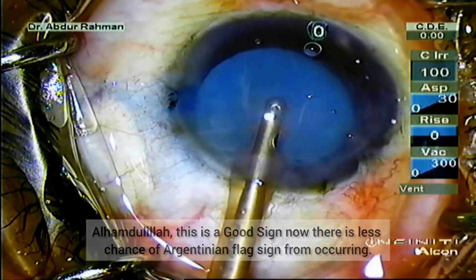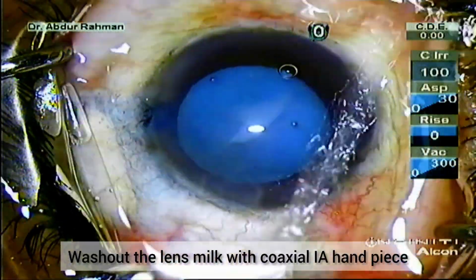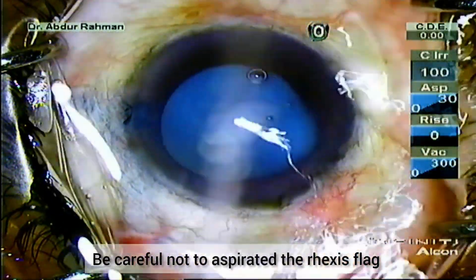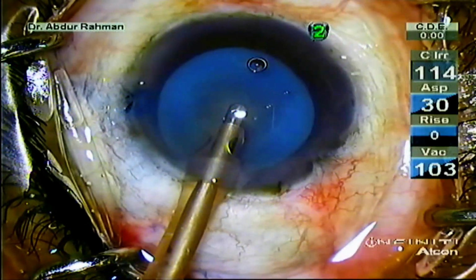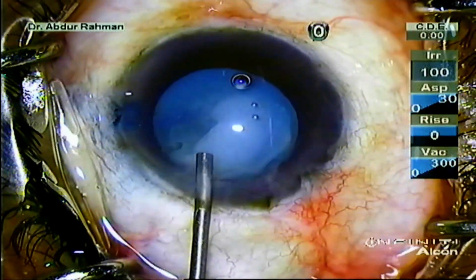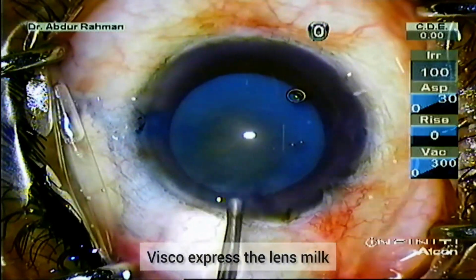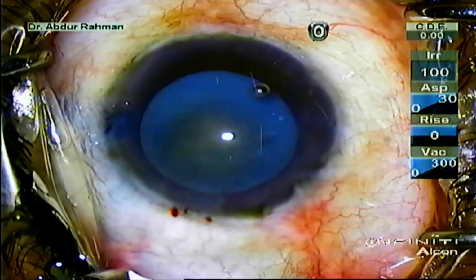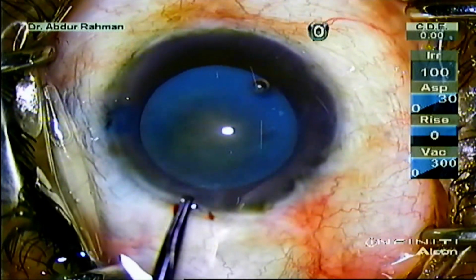Alhamdulillah, this is a good sign because now there is less chance of the Argentinian flag sign occurring. With the help of a coaxial I/A handpiece, wash out the liquefied cortex. Care should be taken not to catch the rhexis flap because it can lead to rhexis extension.